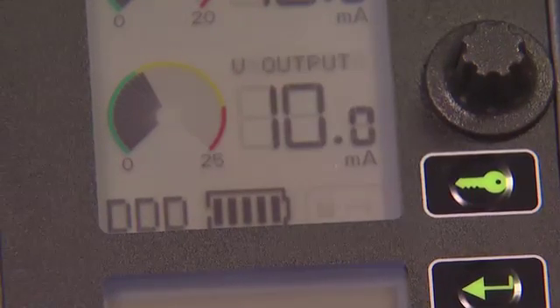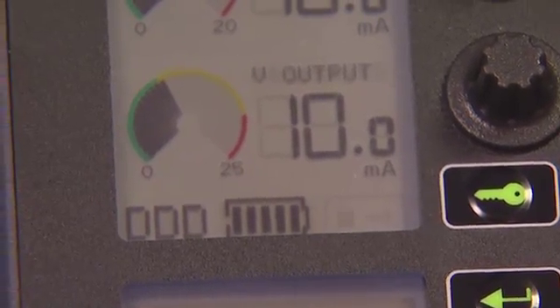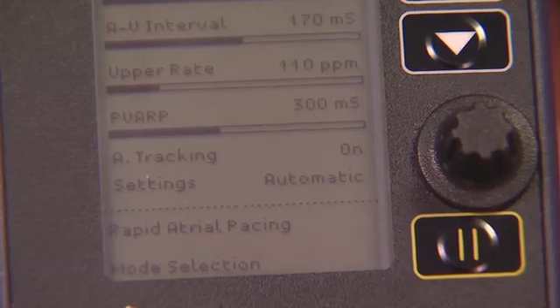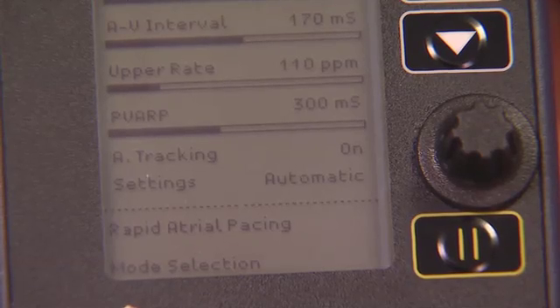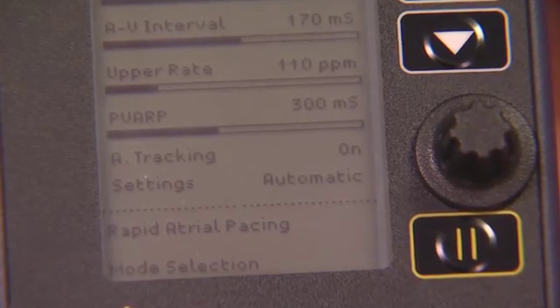Can you tell me what A tracking is for? Sure. With atrial tracking on, ventricular pacing will follow or track the atrial intrinsic rate. With atrial tracking off, the ventricle will always pace at the selected rate no matter how fast the atrium beats. So I would turn atrial tracking off for a patient with intermittent atrial arrhythmias?